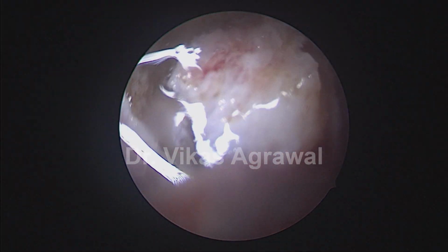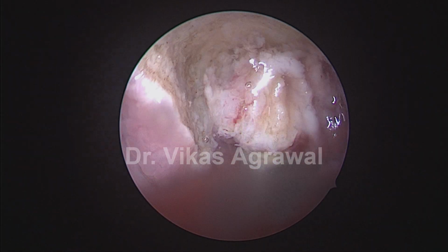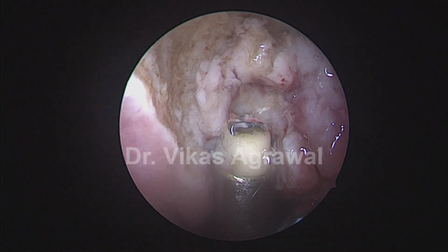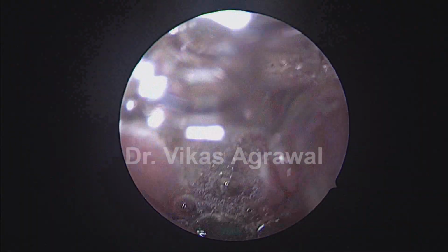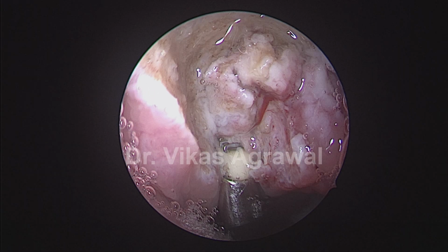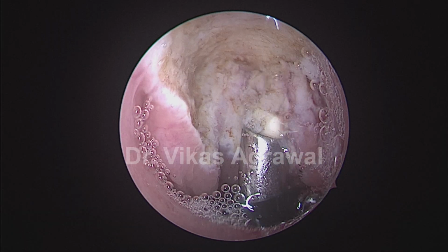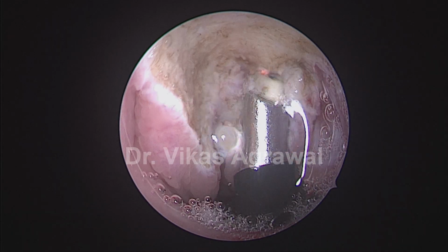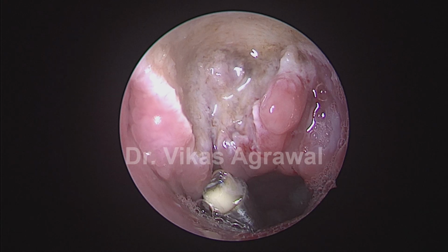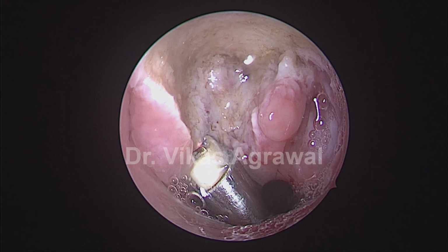Now, unless I debulk, some saline please. Unless I debulk, I'll not be able to see things. Thank you. You don't need to take your scope in and out, but you can actually simply ask the nurse to pour some saline.